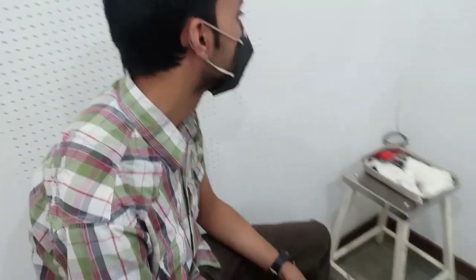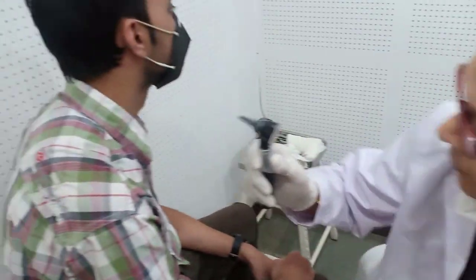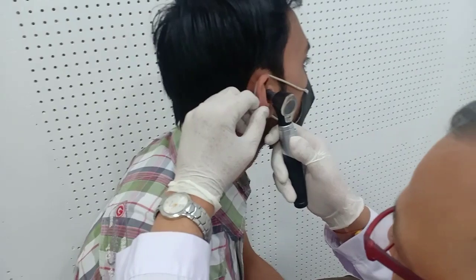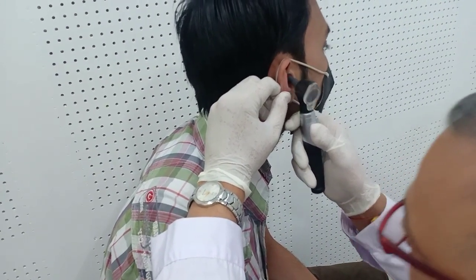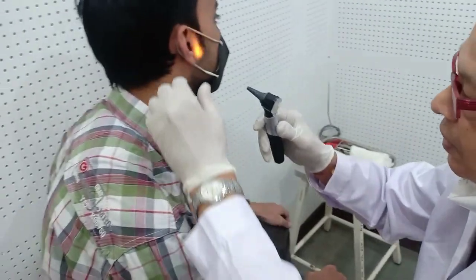So this is one method. There is another method in which you can also hold it. In some of the books they say that you can hold it like this, and then again you retract the pinna and introduce it in this way. Both methods, whether you hold it like this or like this, are correct. Whichever is convenient to you, that you can use.